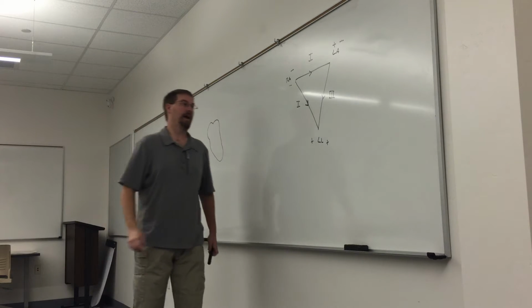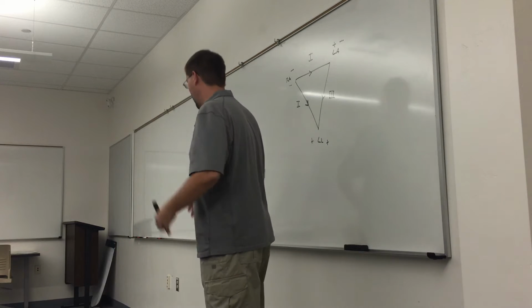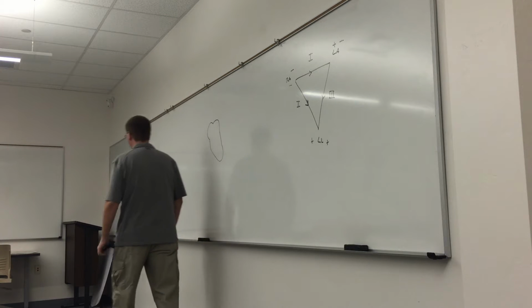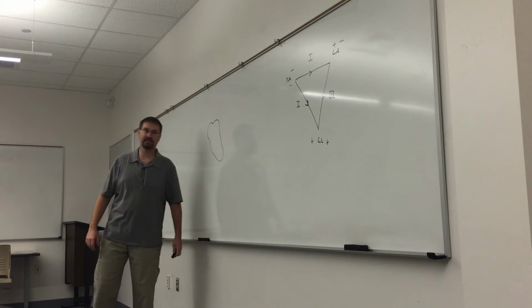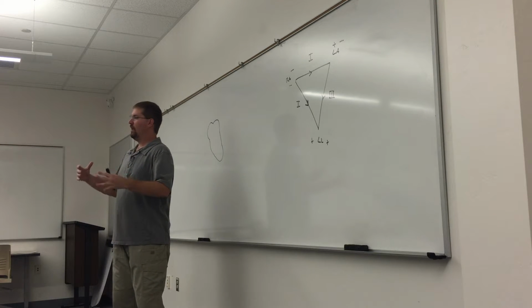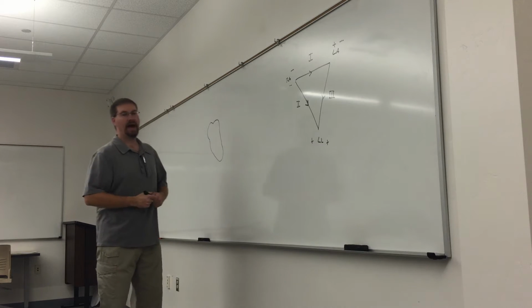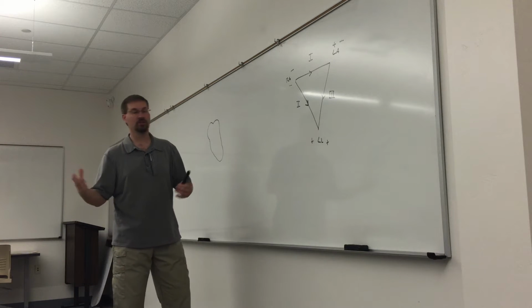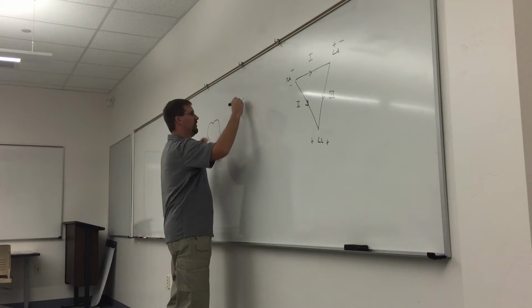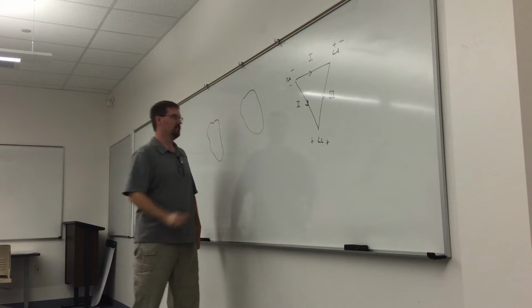Yes. All right. Now, we're going to use this to build upon a concept known as axis. So what the heck is axis? Well, axis, the cardiac axis, is the mean or the average direction of all the depolarization of the heart. Okay? And how it's actually determined with the ECG is if you look at the heart. All right, I like this drawing of the heart, so I'm going to keep this for when the art gets real crazy. But I'll draw you guys a new heart here.